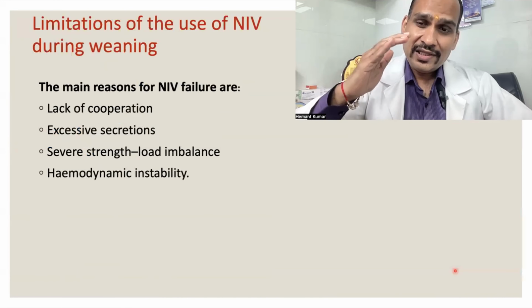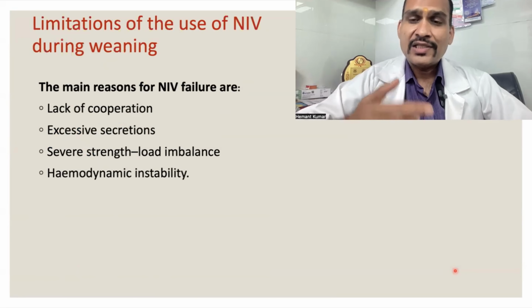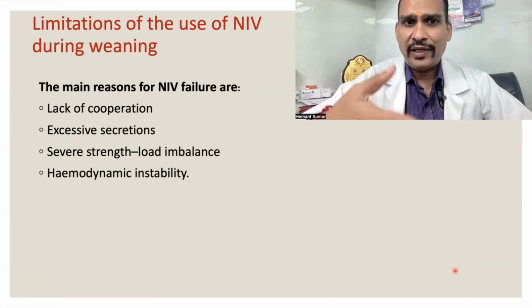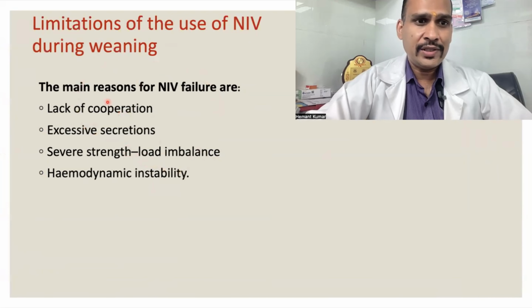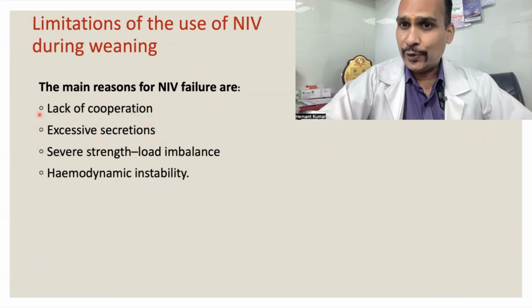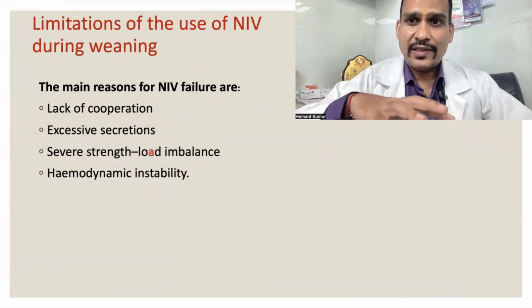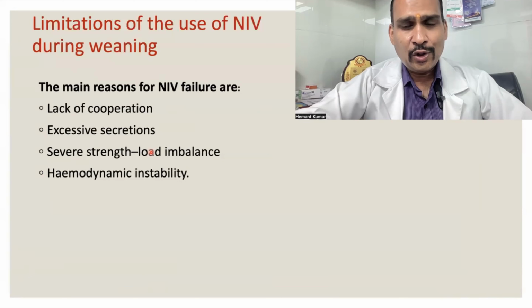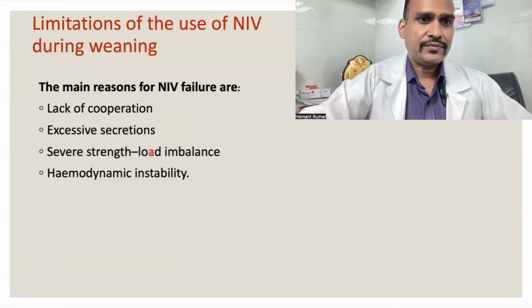But will every patient get benefit from NIV in weaning? No. Some patients fail even after applying NIV. So what is the cause of NIV failure after extubation? Lack of cooperation. The patient is not cooperative. Excessive secretion, very important. If there is excess secretion and you apply NIV, it may cause drying of secretions inside the airway, and it will cause airway narrowing and ultimately weaning failure.